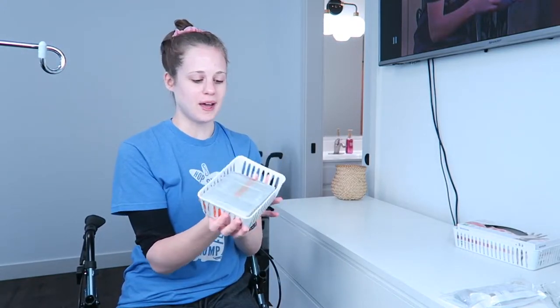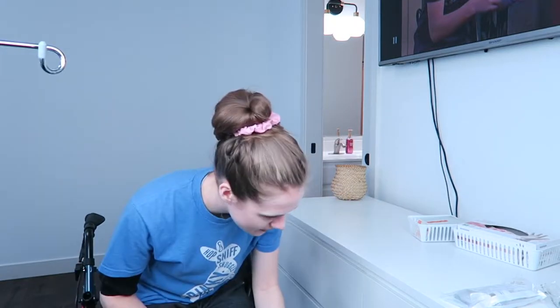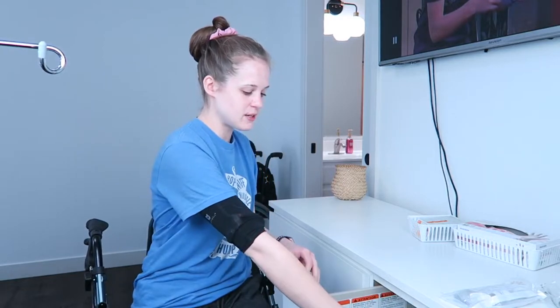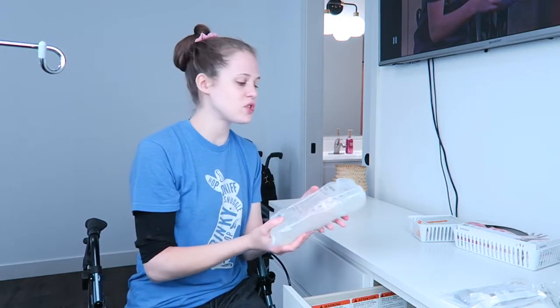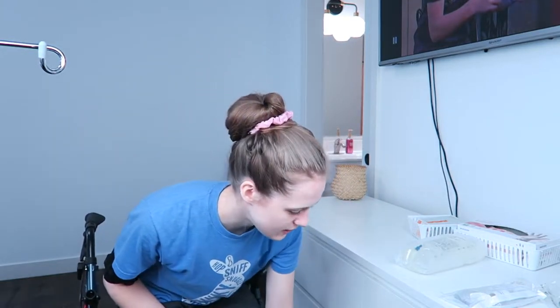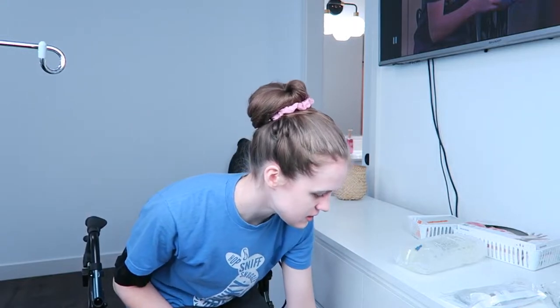This is my alcohol swabs. That's all I need from there. I'm also gonna need a bag of fluids, obviously, because this is what I run for my infusions. It's just a bag of normal saline. And I believe that's it. If I forgot anything, I will get it along the way.